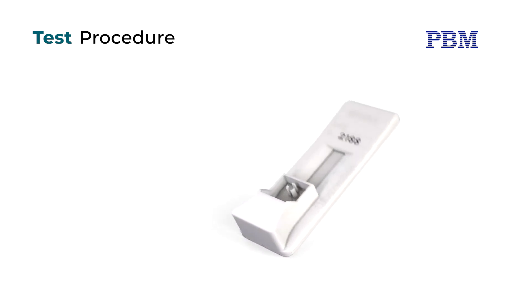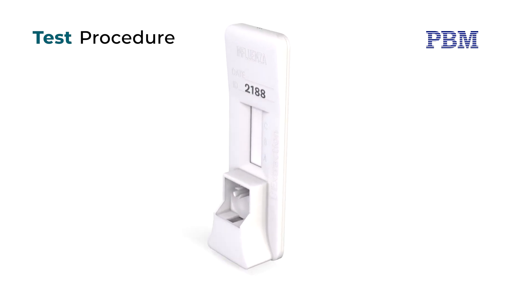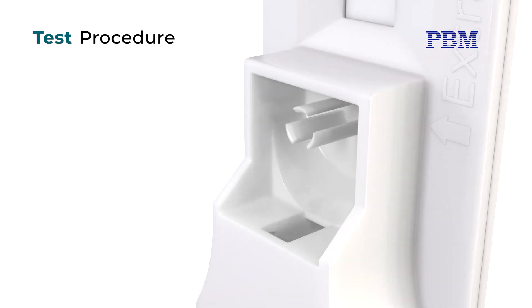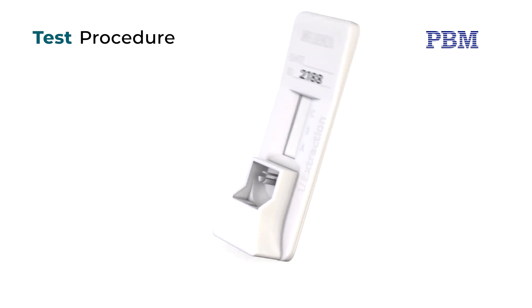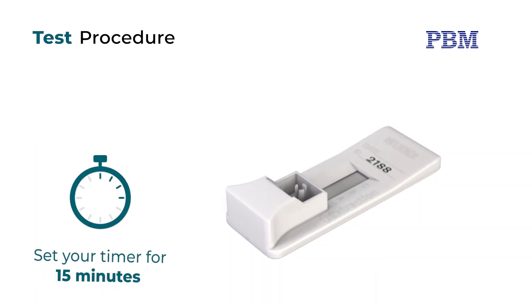Slowly raise the test device on its end to an upright position and allow to stand for one to two seconds. Gently tap the cassette on the counter to ensure all of the liquid flows from the extraction well into the hole. Lay the cassette back down onto a flat surface and set a timer for 15 minutes.